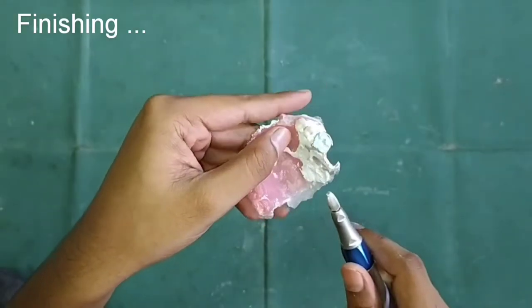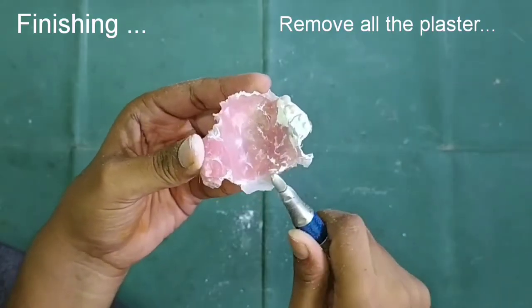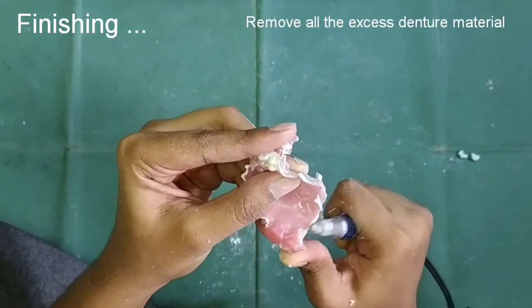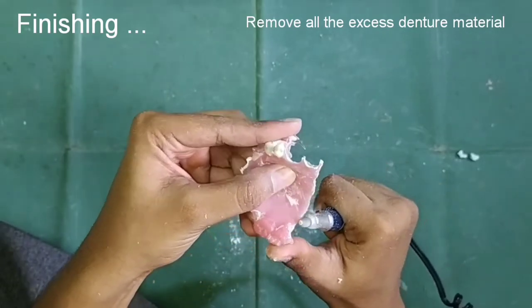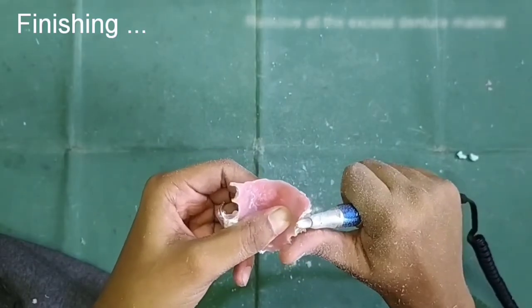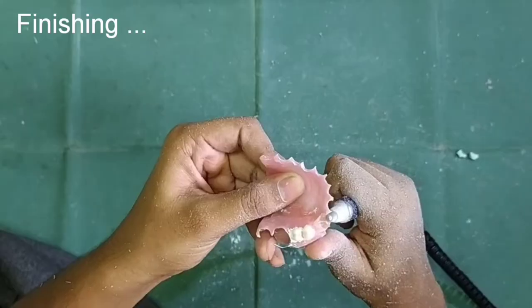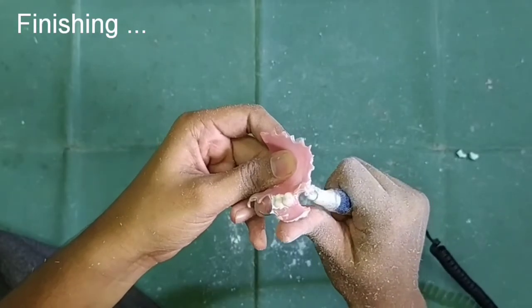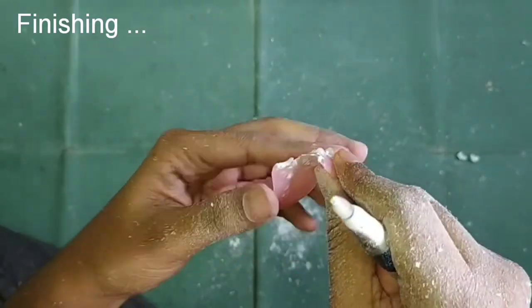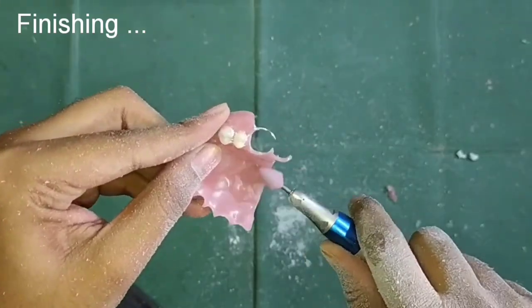The remaining excess material we will remove using the straight handpiece and burrs. Trim it off from all the sides, finish it properly from the cervical region, and give the proper shape to the tooth so it fits correctly. Clean it with water.